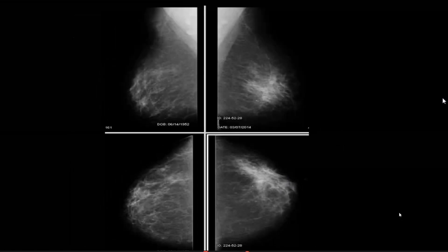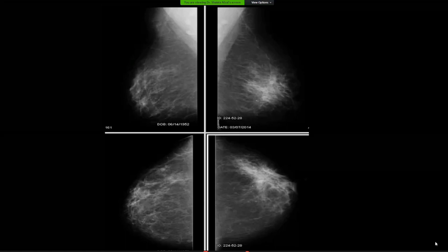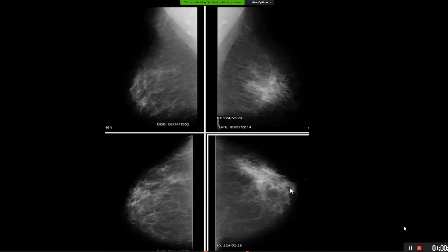This is a case of screening mammography. We see an asymmetric density on the left side — compare the two sides and you can clearly make out an ill-defined asymmetric density on the left. This is a case of lobular carcinoma. Lobular carcinomas differ from ductal carcinomas in that they infiltrate through the breast parenchyma; they may appear as asymmetric increased density and may not form a mass. Whenever looking at a mammogram, compare the two sides and look for asymmetric densities and architectural distortions.